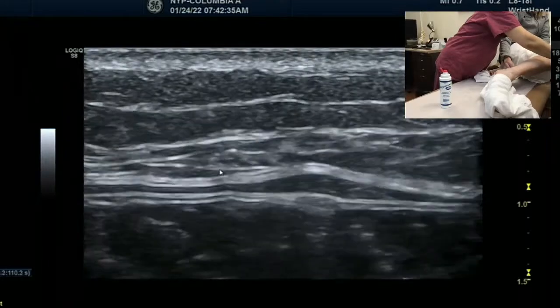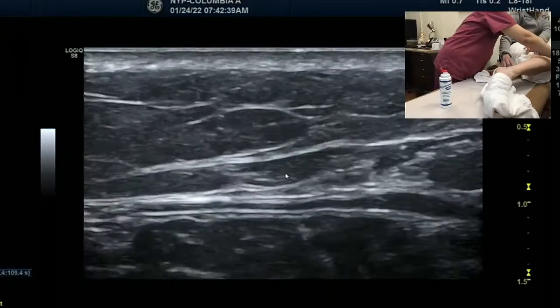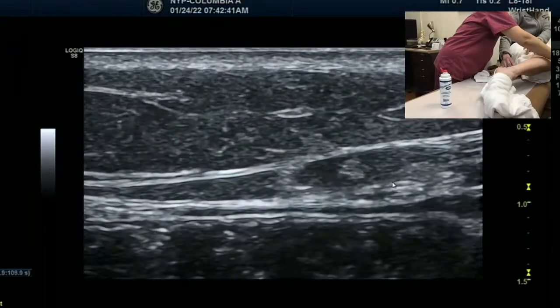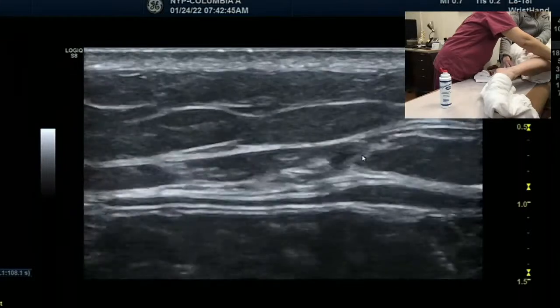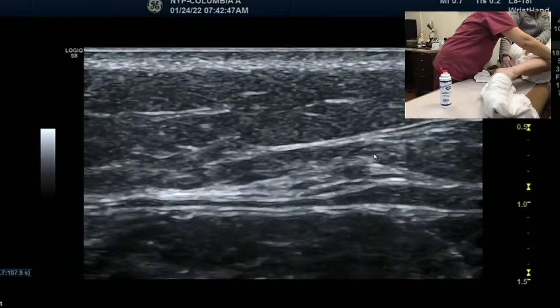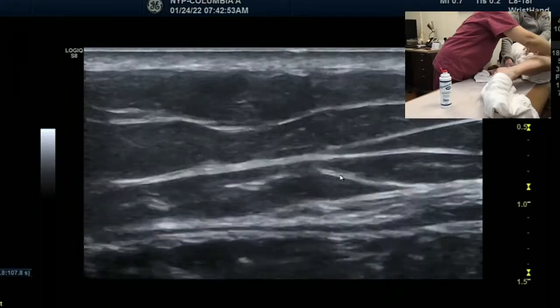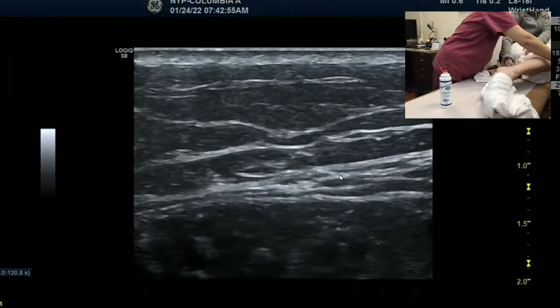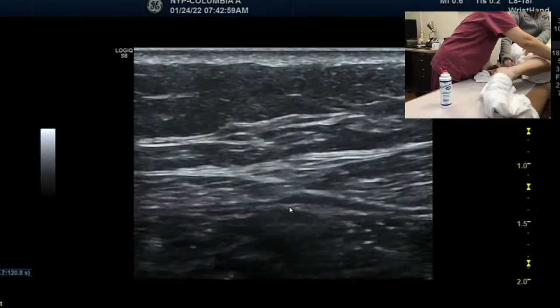It's down deep, which we would expect. Now she passed the 14 centimeter. Over there, right? This one? Can you scan up and down? Here. Okay, go up continuously to the middle. There. Now they're meeting.